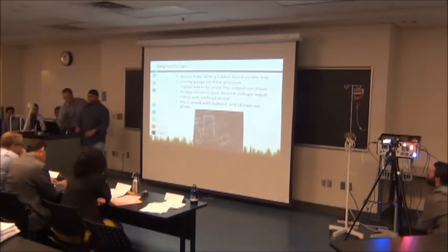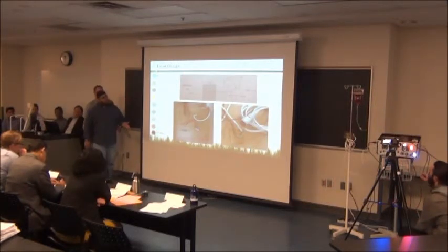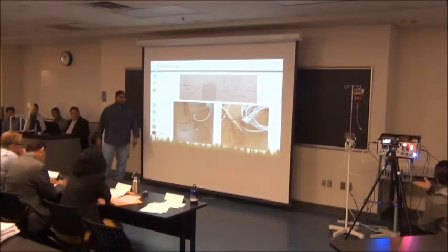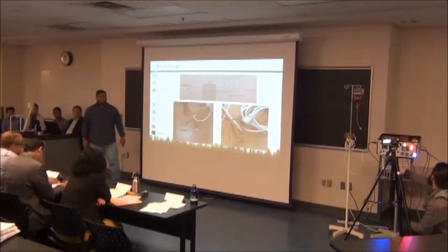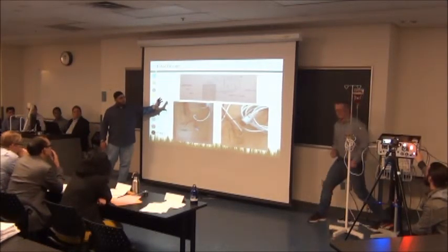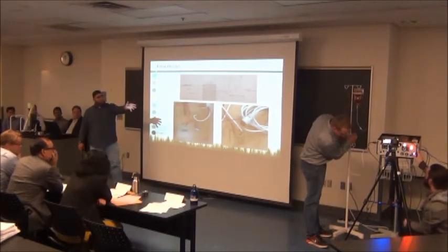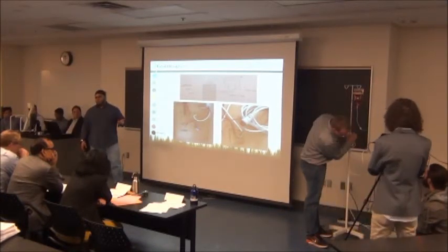All right, so I'm Faray, as I mentioned before. So this is our final design. It's much simpler as compared to before. This is something we're always trying to do in healthcare technology, making it simpler, easier to use, easier to implement. So in this case, the acrylic tube is replaced by the IV bag. As we can see over there, the IV bag hanging. This IV bag contains liquid. This would be blood in the transducer.